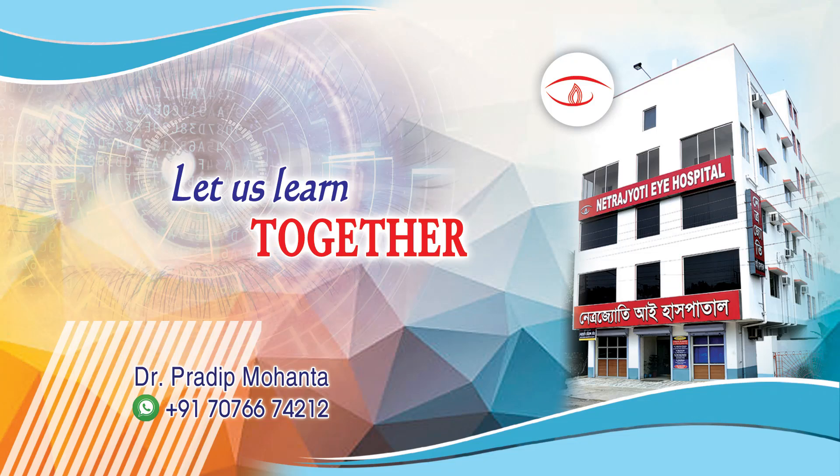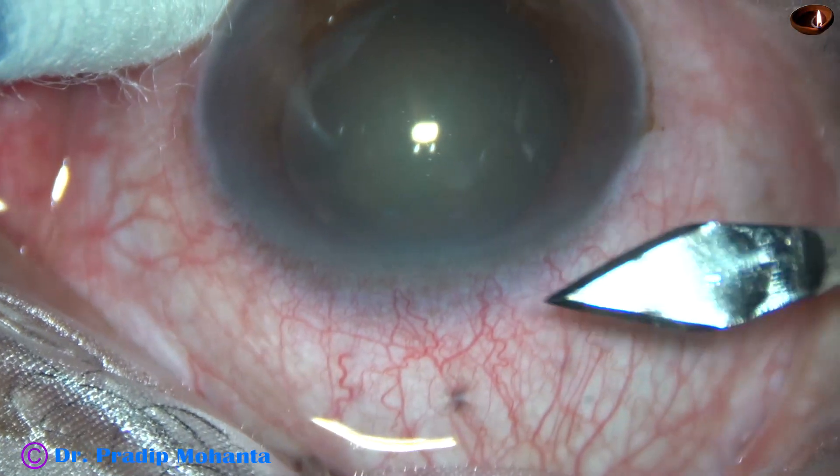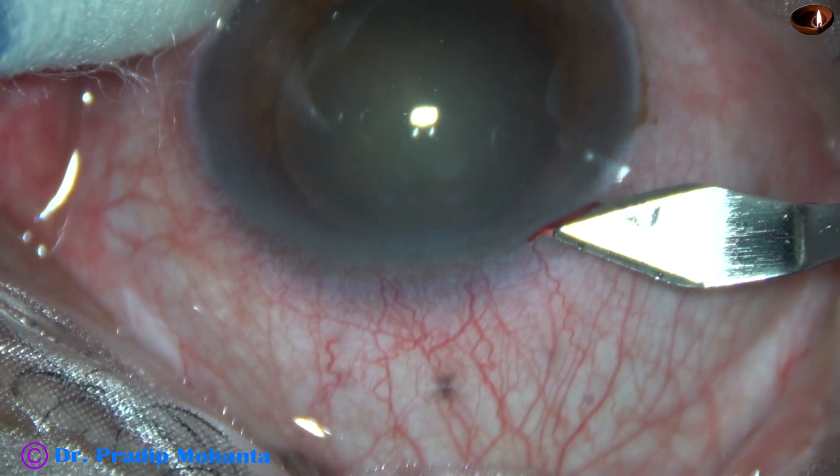Friends, welcome to my workplace at Ranaghart, West Bengal, India. A lot of interesting things happened in this case. Let us observe this surgery.